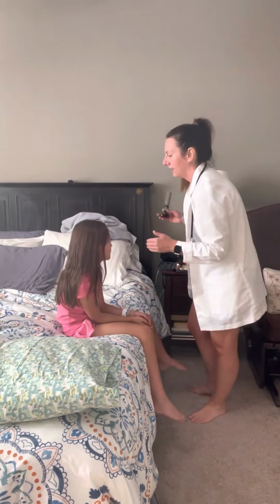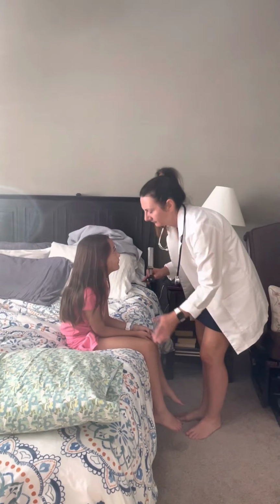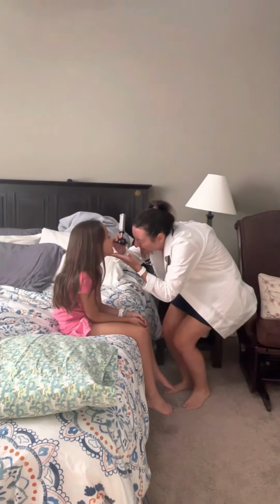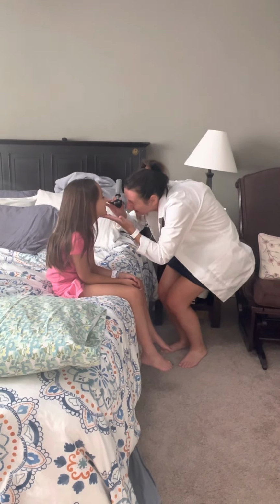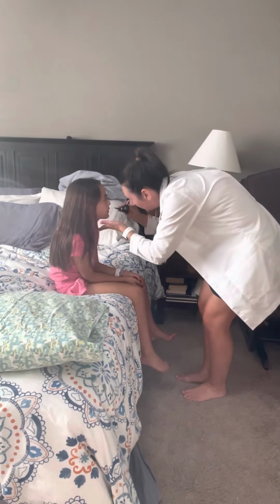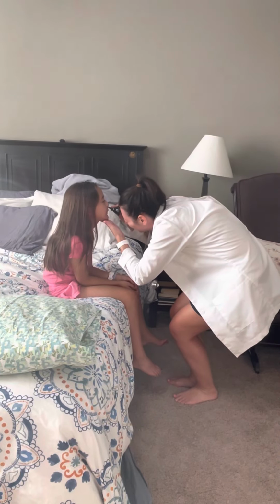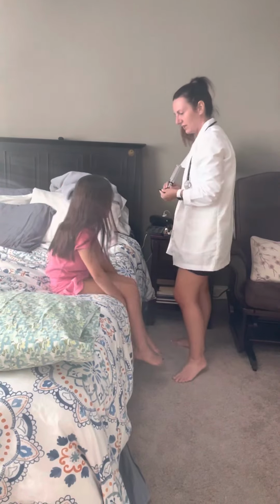Then I'd go ahead and look, and now this might tickle your nose just a little bit, okay? So then I would look up her nose, look at the turbinates, make sure everything looks good and there's no polyps or obstructions or any of that. And then I would look at the other side. You okay? Okay. So then we would do that.